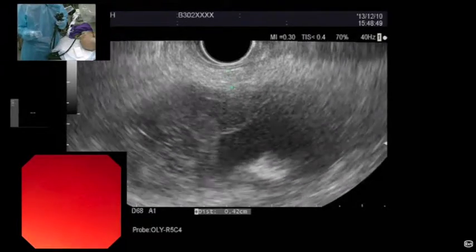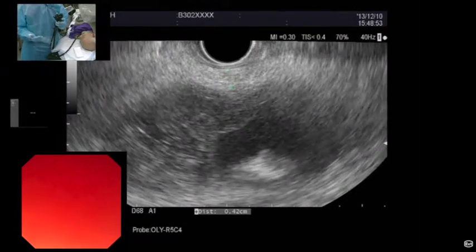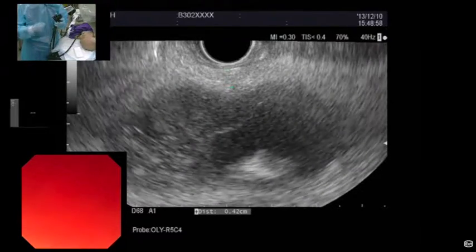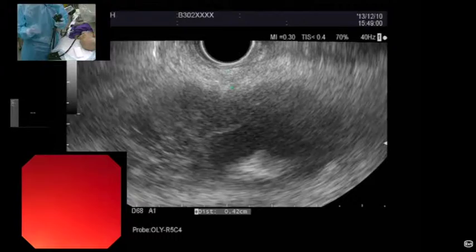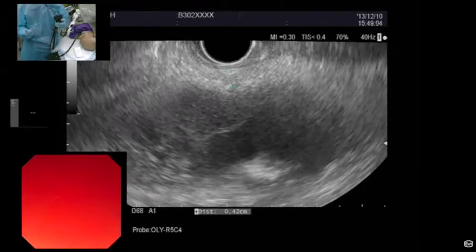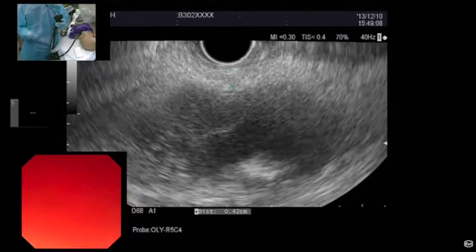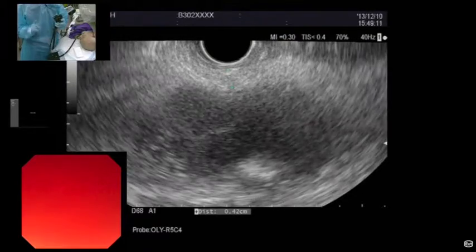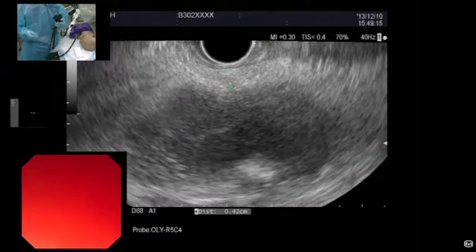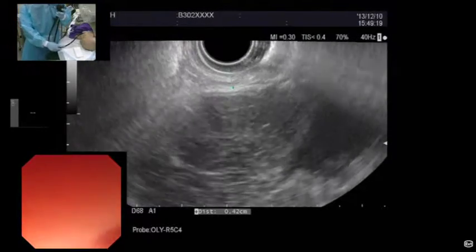Ideally, we want to eliminate any exchanges over a guide wire, because it's during an exchange of a dilating instrument over a guide wire that leakage can occur. And we would also ideally like to eliminate the dilation of our tract to insert our stent. Now, obviously, the only stent you could use in a situation like this would be a covered metal stent. So this is maybe an opportunity to show you a new stent.